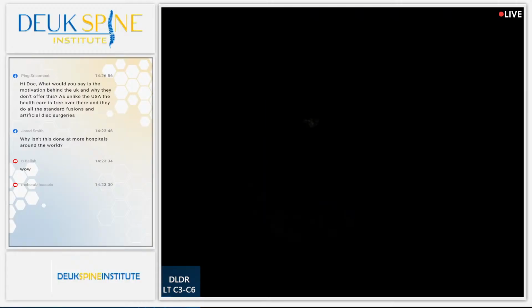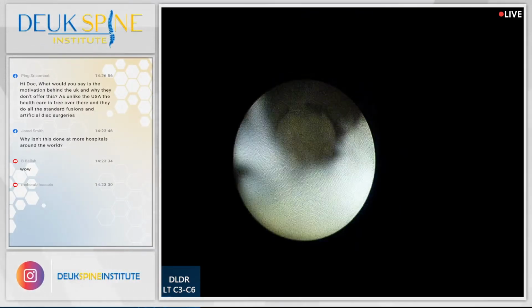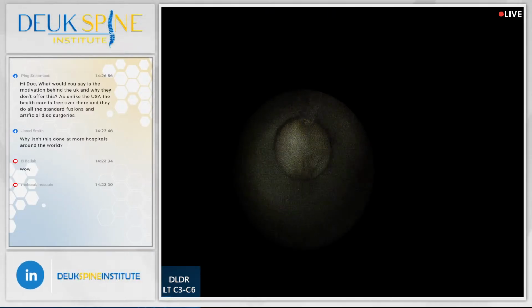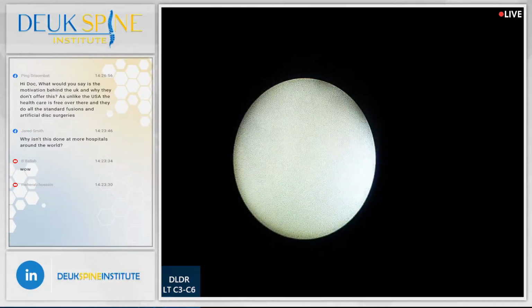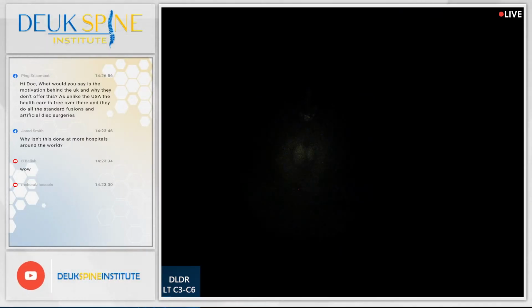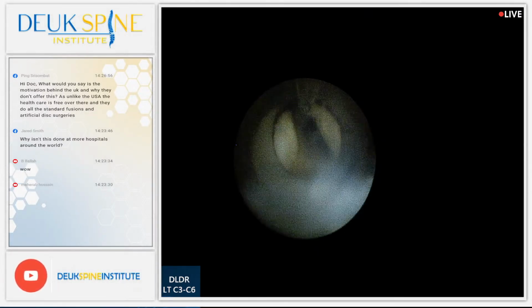Awesome. Now, I also think, just for the record on her, she said she woke up from her first surgery and she was worse. I think they probably cranked her neck during surgery, caused all these other discs to herniate worse. Look at that. I mean, that's the foramen.